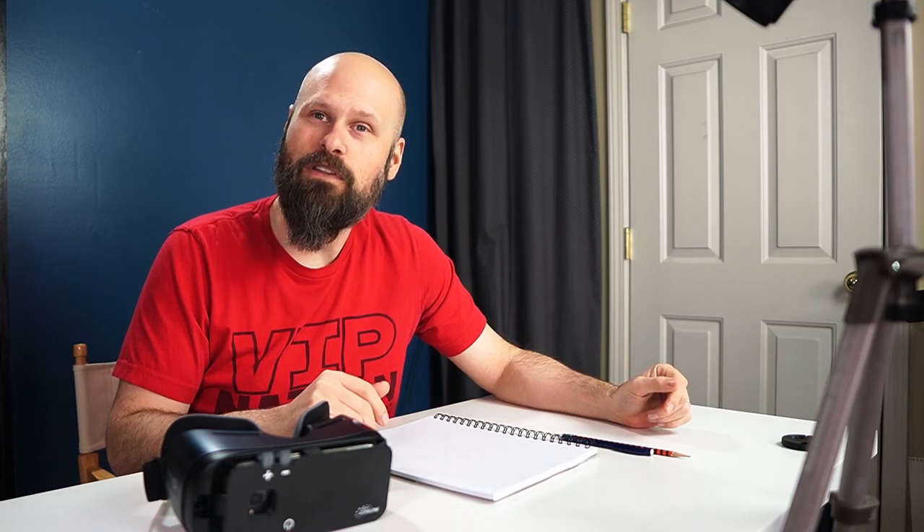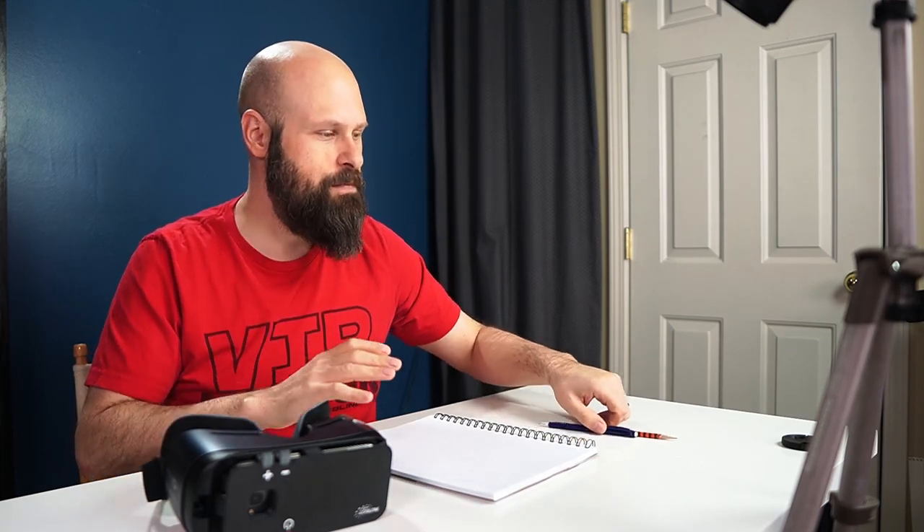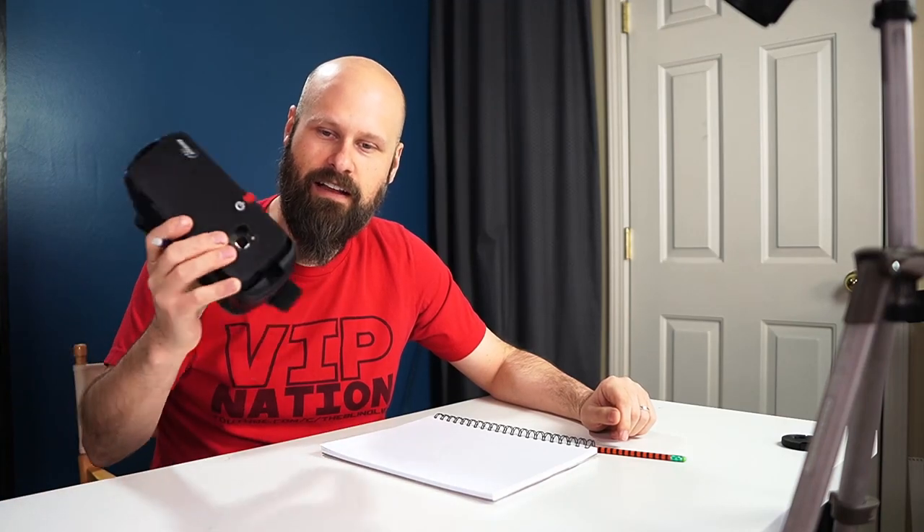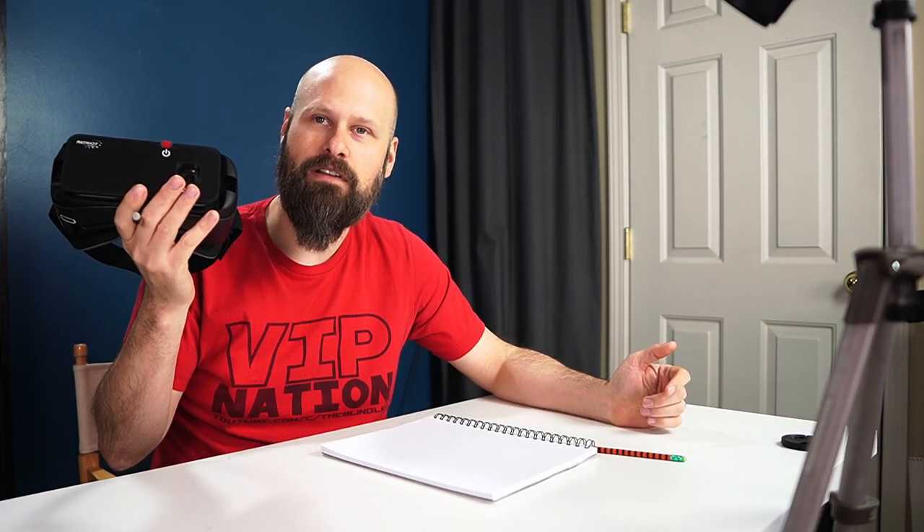I've got a bunch of cameras set up to hopefully document this process. It could go very, very wrong because I haven't drawn in a long time. The skill of creating art is very much like anything — if you don't use it, you lose it. I know that I can't draw as well as I used to, and that's very sad. So don't judge this too harshly. If it turns out looking like garbage, I'm sorry. It's a learning process, and using assistive technology like a wearable device is going to take practice.